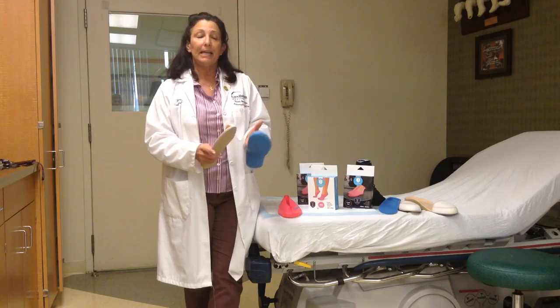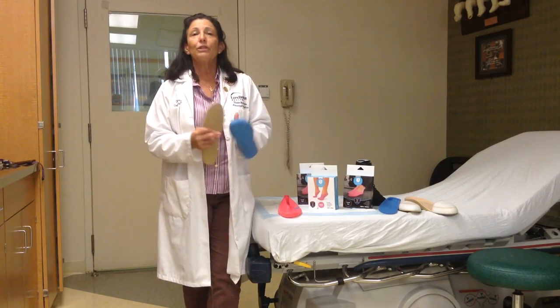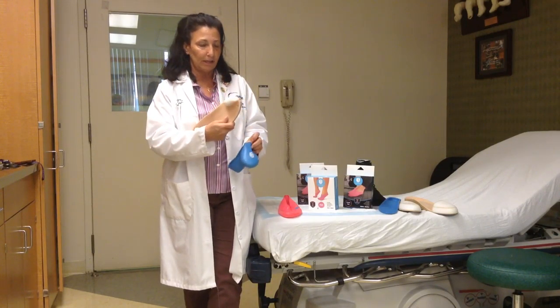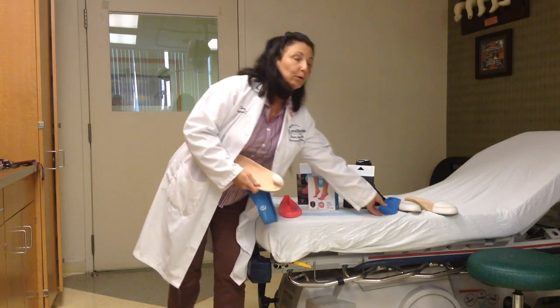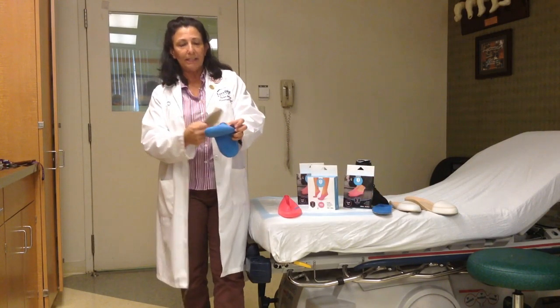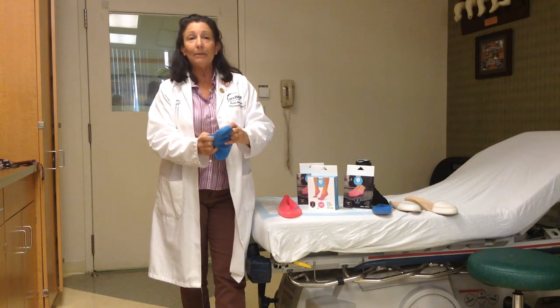The jelly feet provides a direct cover over the orthotic, which is fabulous, because my patients can now take their custom orthotics — whether it be a toe filler or a regular orthotic — and don the jelly feet directly over the toe filler, and it is seamless.